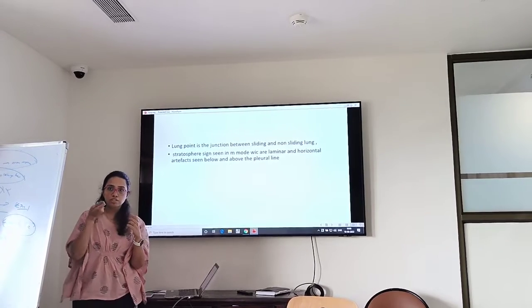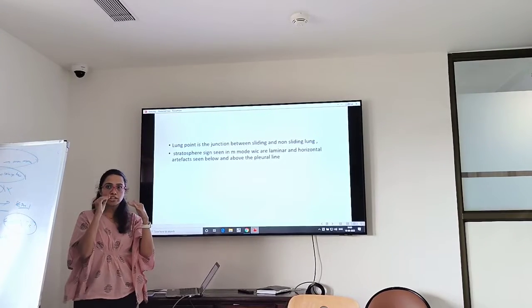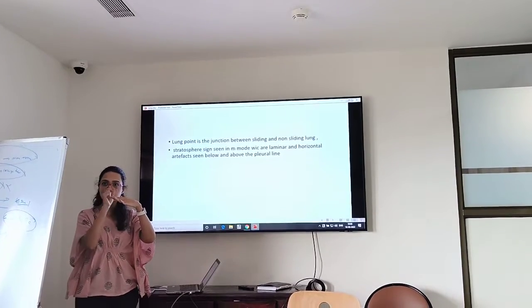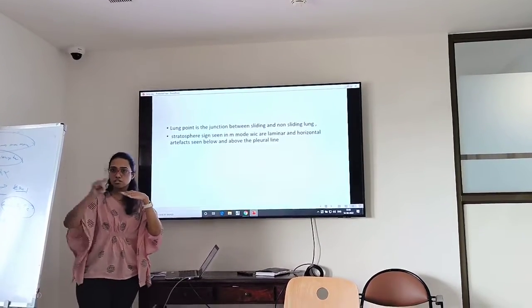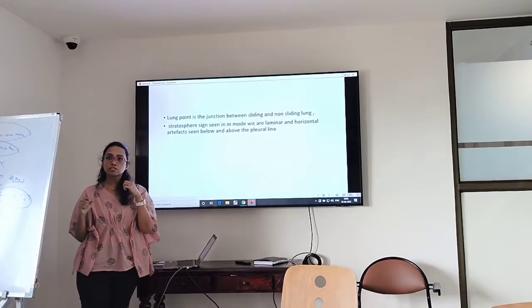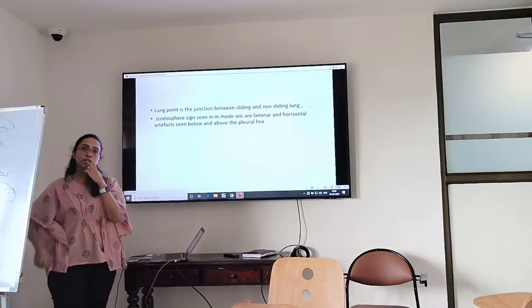In the M mode, sir, when we place it, there is a point where we see there is sliding, but there's a particular segment where the sliding disappears and we just see horizontal lines. No. So see, you must understand what is the M mode.